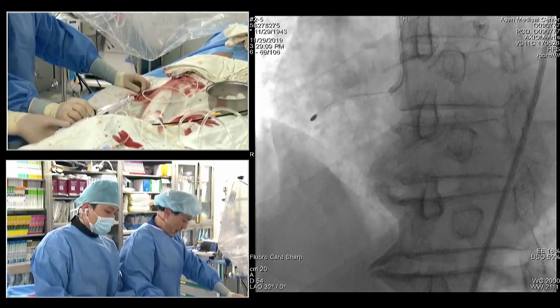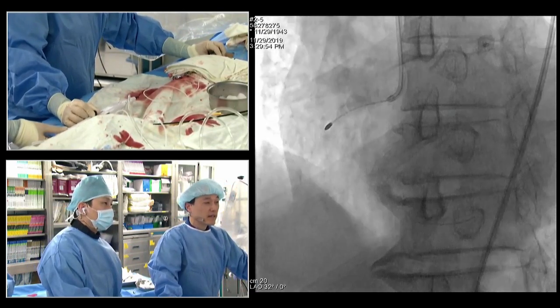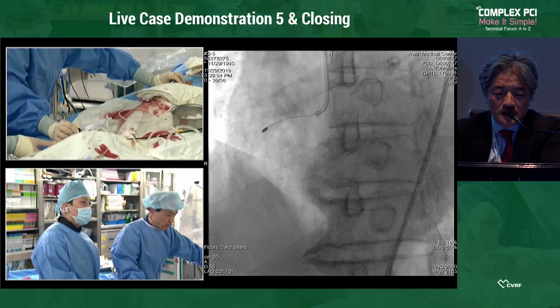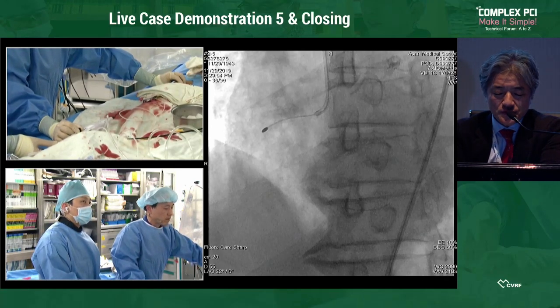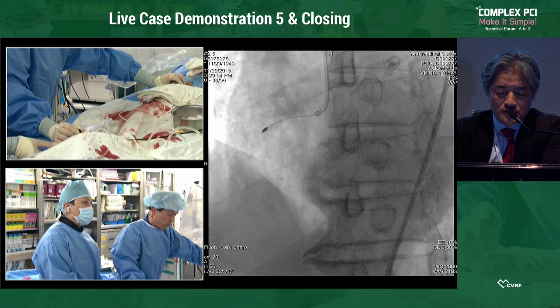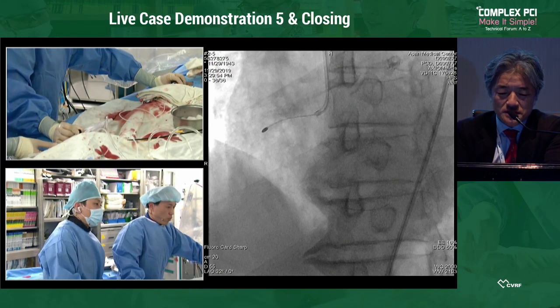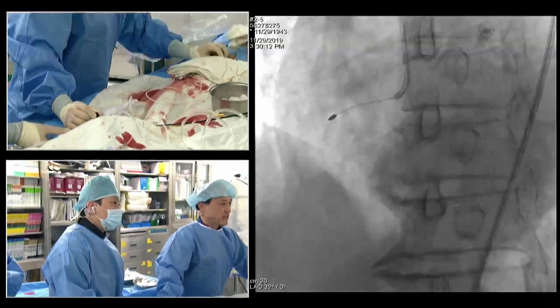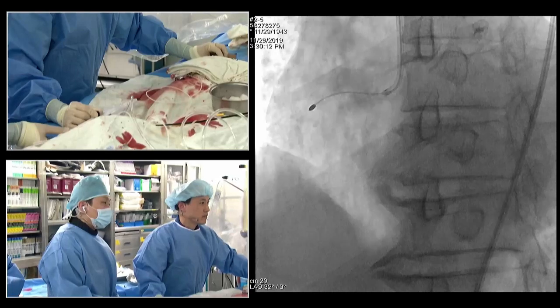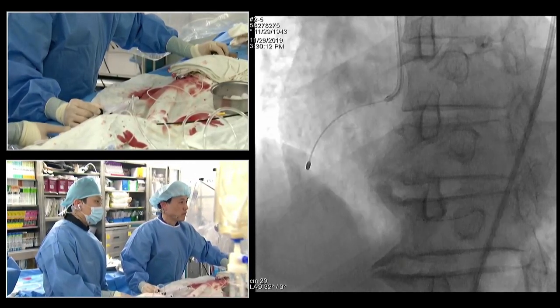All right, I think one more question. Dr. Lee, I'd like to ask: this patient has LAD severe stenosis, and when you do rotation, we actually need a pacemaker. So you don't have the insert of the temporary pacemaker for this patient? Well, the LAD has been revascularized. It's stented. Already stented. LAD? Yes.